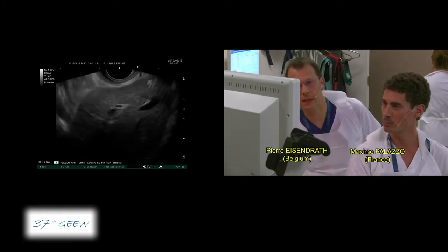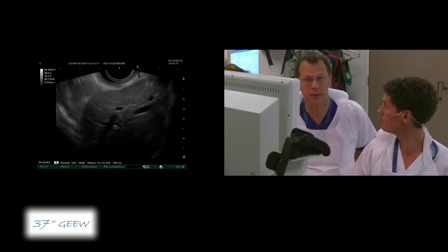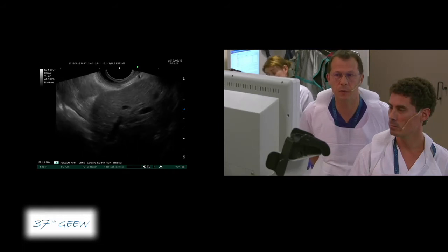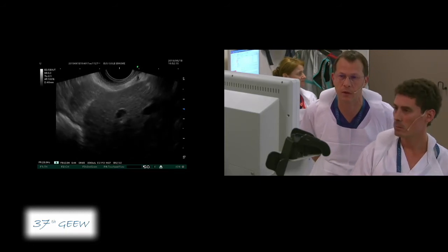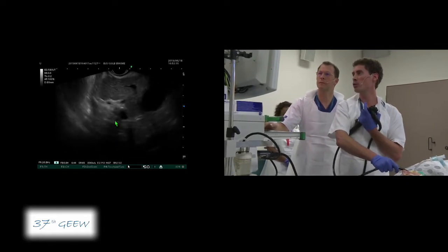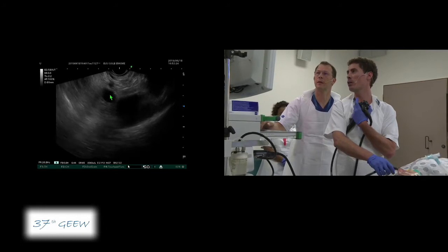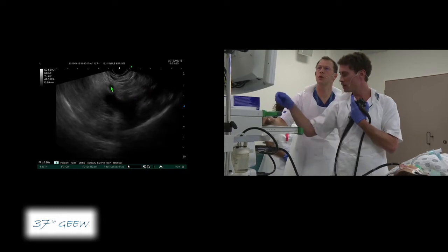This technique may be used when you have a patient with an atrophic pancreatic body or tail, and it's a way to identify the aspect of the remnant pancreatic parenchyma, which is always visible between the probe and the portal vein and the circumference. That's what we will demonstrate now. Exactly. So this is the portal vein. And if I turn slightly clockwise, you see the portal vein is going outside from the liver. So we are just at the level of the hilum, and just above, this is the hepatic artery.